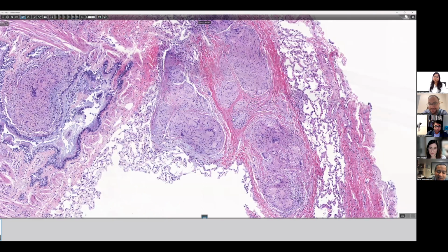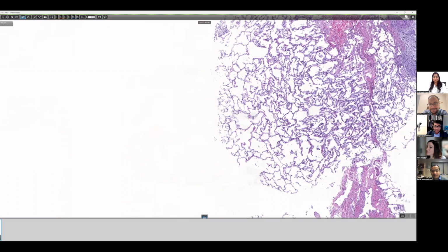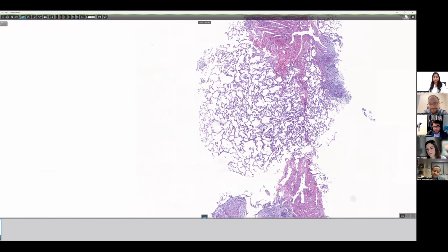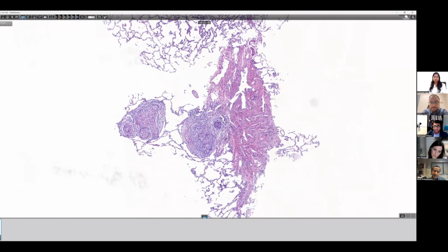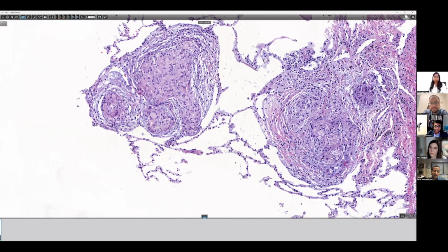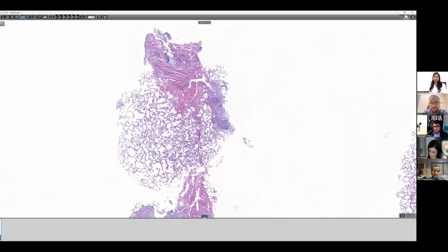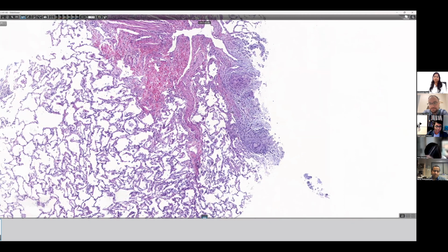Let's hear Raghav and Sharada, then I'll give my opinion. I pretty much do the same thing as Matt. Infection is something I always think about, but in this case I agree that the clock is more towards sarcoidosis, with the appearance of the granulomas and hyalinized fibrosis around them, which correlates with the CT findings too. I will also check the CT to see whether hilar mediastinal lymphadenopathy is present or absent. It fits a lymphangitic pattern distribution of the granulomas, and they're very hard granulomas.